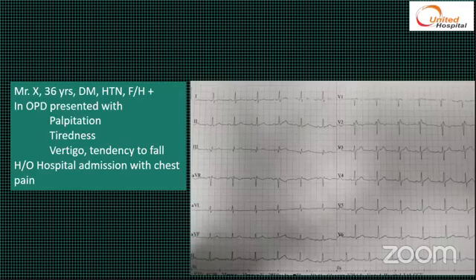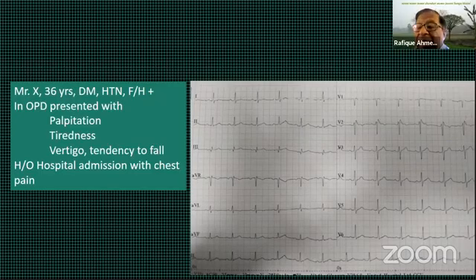Now, Arafat, any comment? Yes, sir, please. So let's stick to lead V2 and its RSR pattern. And if I measure the QRS duration, it's about 160 milliseconds.